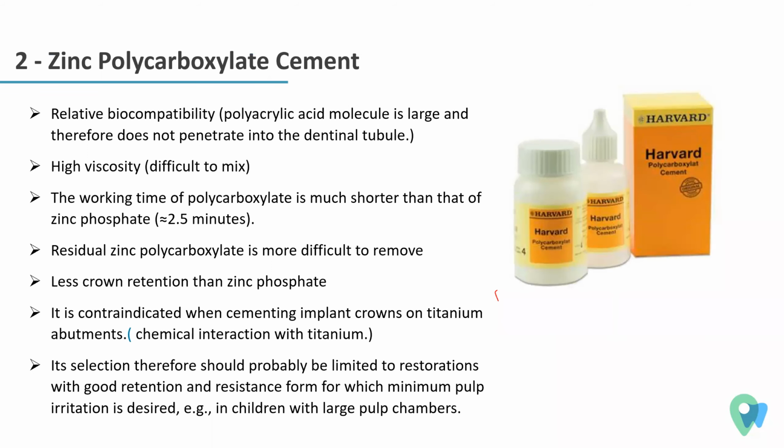Zinc polycarboxylate cement. It has relative biocompatibility. The polyacrylic acid molecule is large and therefore does not penetrate into the dentinal tubule. It has high viscosity, which means it's difficult to mix. The working time of polycarboxylate is much shorter than that of zinc phosphate. It's around 2.5 minutes.